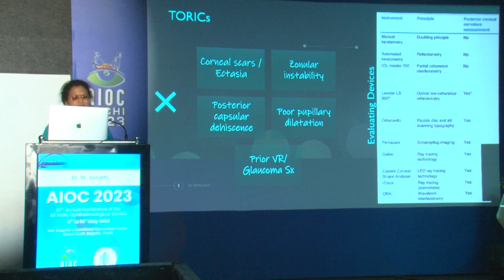So that's why we are emphasizing so much on correcting astigmatism in our patients here. The next is we should know which are the patients in which we can probably give torics, or in those we probably do not want to give torics or consider torics here. So wherever you're looking at a cornea with a higher quantum of irregular astigmatism, those are the corneas in which you would probably be skeptical about placing toric IOLs here.